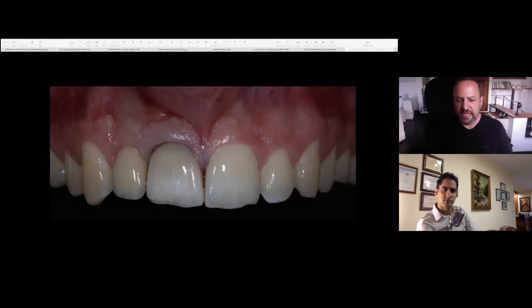And then in goes the provisional crown, and I call it a walkout as you walk in, because the patient looks no different. And I think it has something from a mental point of view.